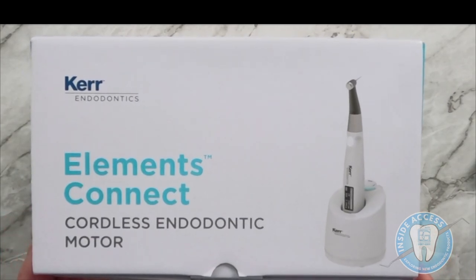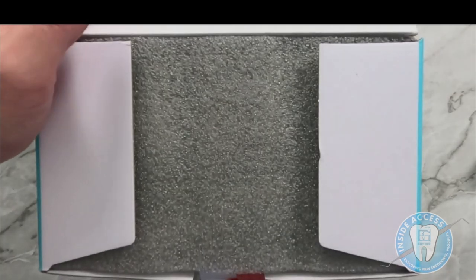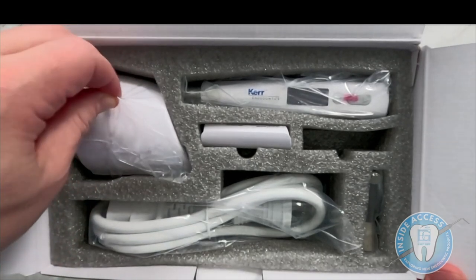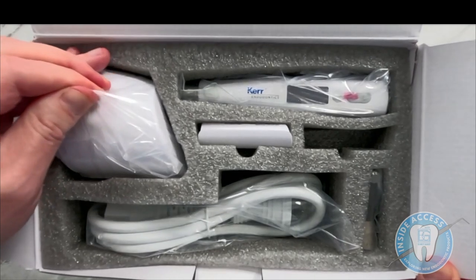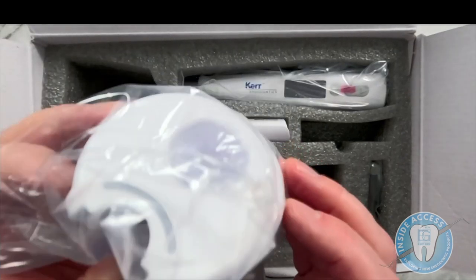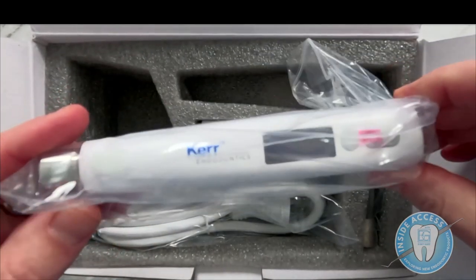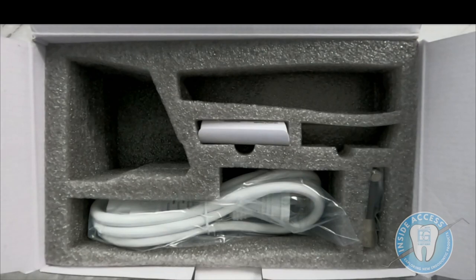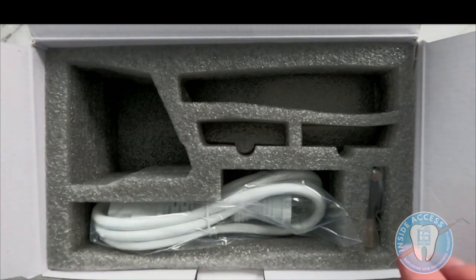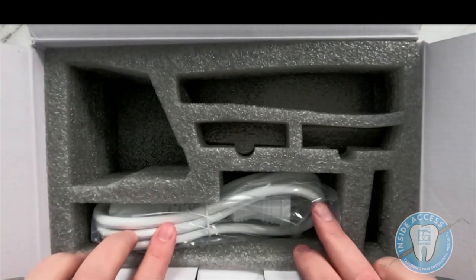The next product is the Elements Connect cordless endodontic motor. Let's take a look inside the box. When you remove the packaging, you'll see the charger base, which has a port for the batteries to charge. The cradle is mainly to hold the unit. You have the unit body itself — very lightweight — along with two batteries (one already in the motor and one on the outside), the contra angle head used to hold the files, and the power cord.